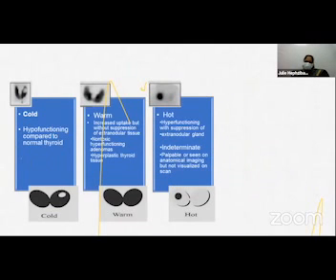So what is a cold nodule? It's a hypofunctioning nodule when compared to the normal thyroid. A warm nodule has increased uptake but without suppression of extranodular tissue, like in non-toxic hyperfunctioning adenomas or hyperplastic thyroid tissue. And hot is when there's a hyperfunctioning nodule with suppression of the extranodular gland. The usefulness of this is that in cold nodules, about 10 to 15% can be malignant, whereas in hot, it's less than 2%, 1 to 2% can be malignant.